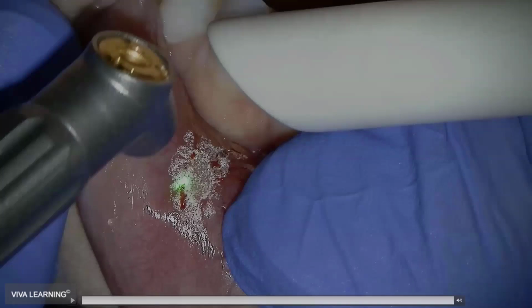Here's the good news. I will often encourage people that this is safer than a handpiece. When I was cutting that tooth, you actually have to hold it there, and you notice my hand was moving pretty slowly. So if you happen to glance away at tissue, it's going to do this. The most it's going to do.